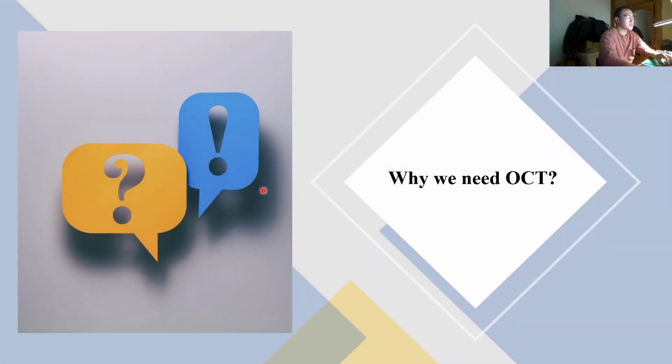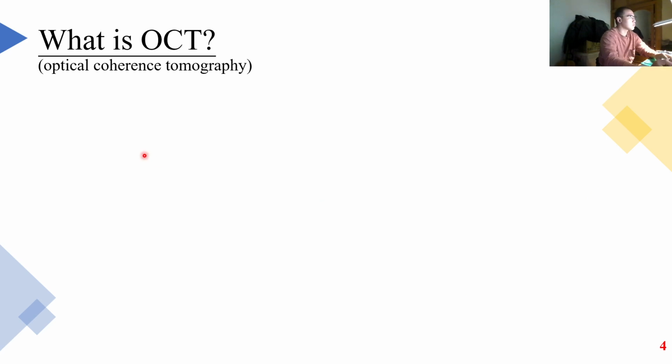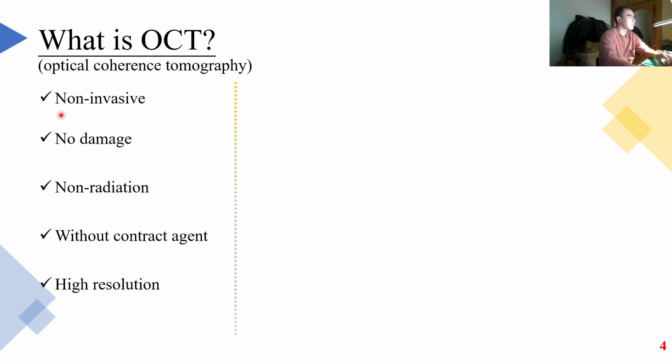So why do we need OCT? Let me tell you what OCT is: optical coherence tomography. It is non-invasive, non-damaging, non-radiating, needs no contrast agents, and has high resolution.